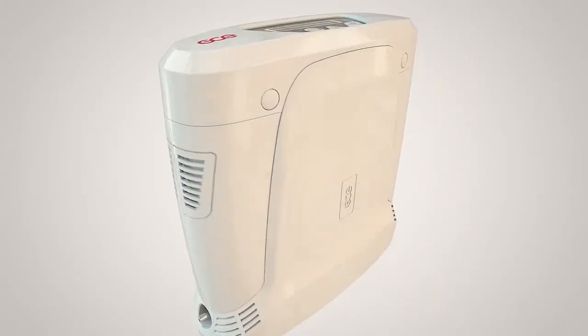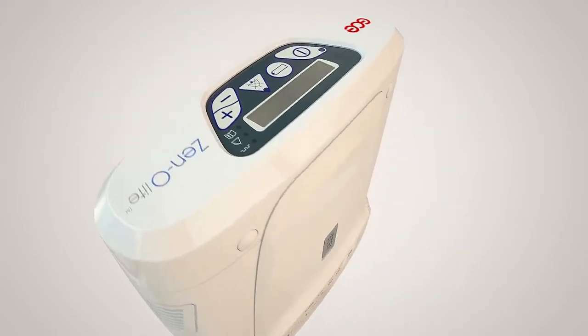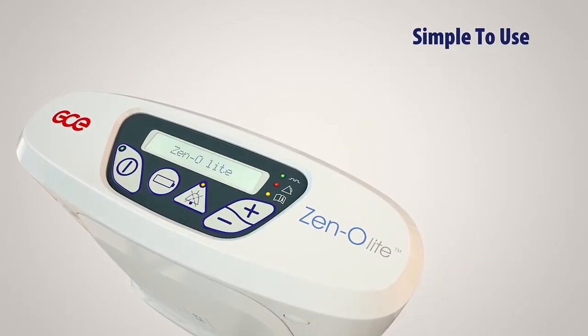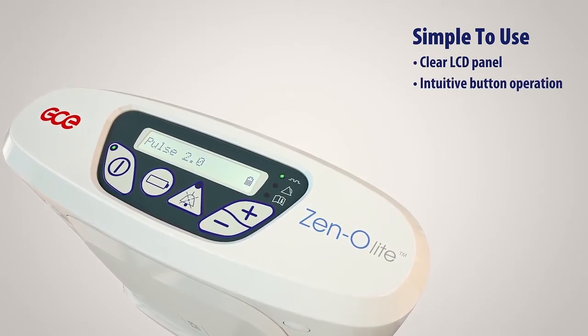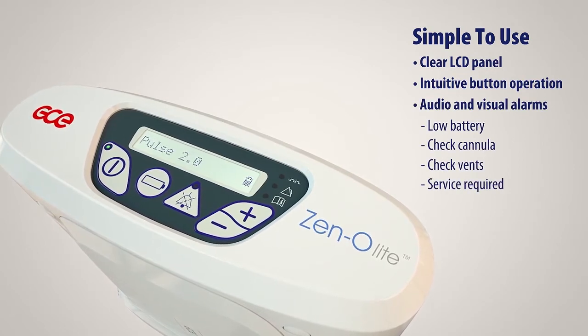Zen-O lite is an advanced and lightweight portable oxygen concentrator designed for active patients that require long-term oxygen therapy. Zen-O lite is easy to operate with a clear LCD panel, intuitive button operation, and audio and visual alarms to prompt the user of a required action.